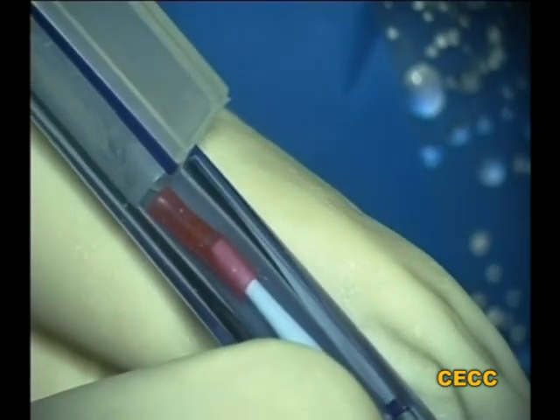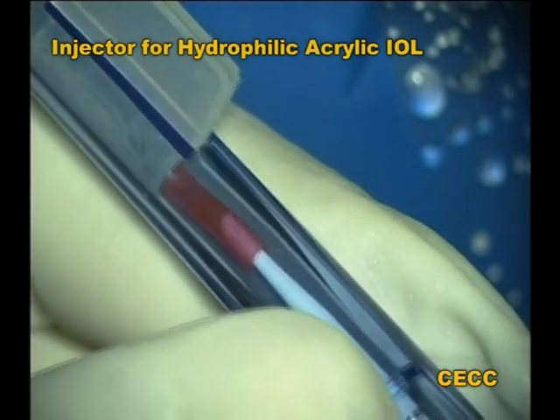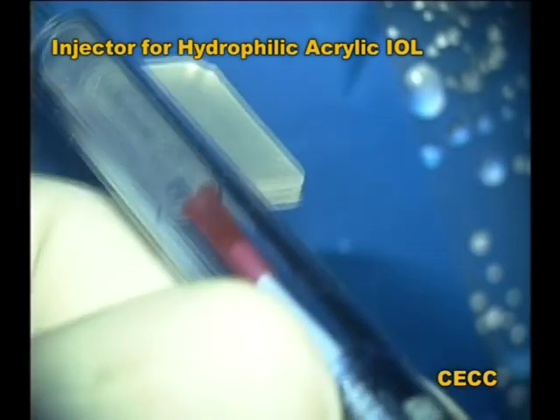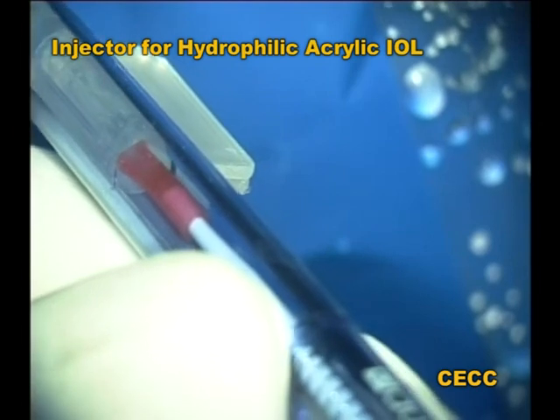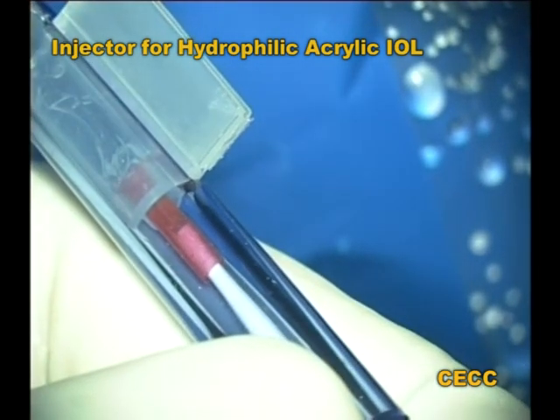In this insertion system for a hydrophilic acrylic intraocular lens, the central plunger with the silicon tip is not properly aligned with the lumen of the cartridge. An attempt to use this system will definitely capture the haptic or the optic between the piston tip and the wall of the cartridge lumen.